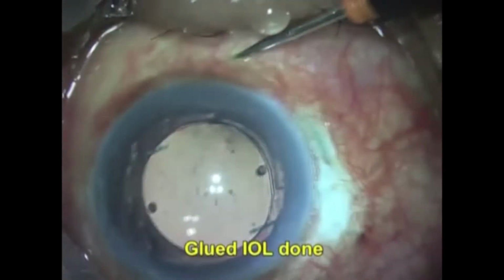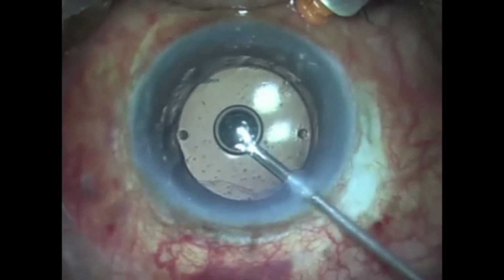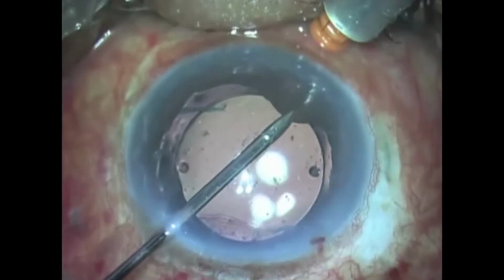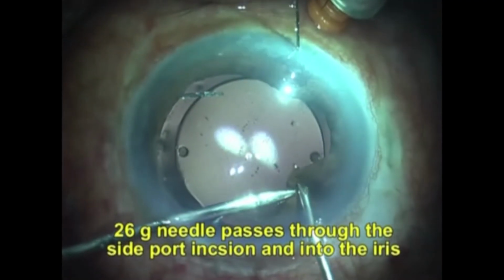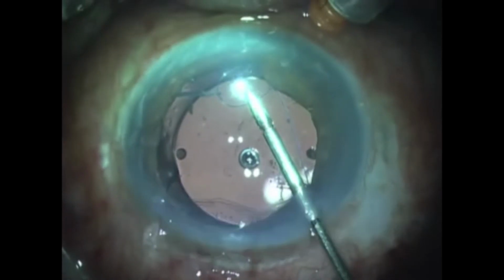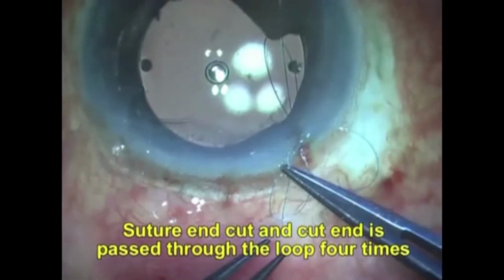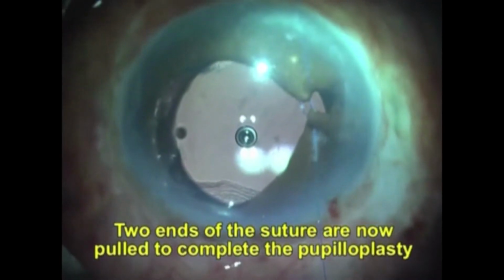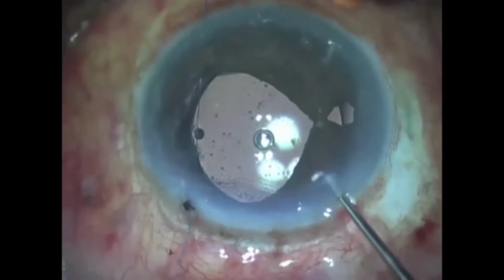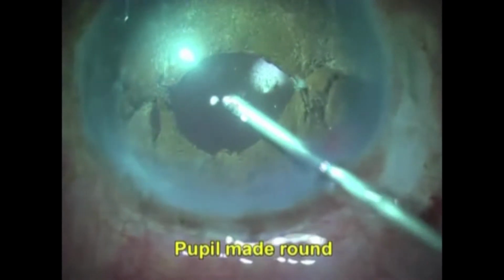Urrets-Zavalia syndrome can occur even after a glued IOL. If the patient has only mydriasis, without a closed-angle glaucoma, photophobia and glare are the main symptoms. These patients benefit from pupilloplasty. An endo-illuminator from outside can help in visualization. In Urrets-Zavalia syndrome, the patient usually complains of decreased vision, glare and halos. On examination, the pupils are found to be fixed and dilated, not responding to either miotics or mydriatics. Following the pupilloplasty, the pupil is brought back to normal size.